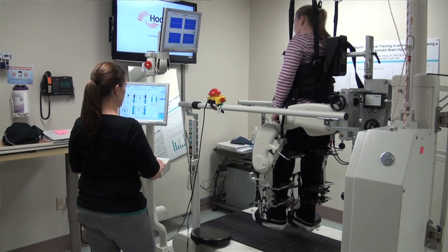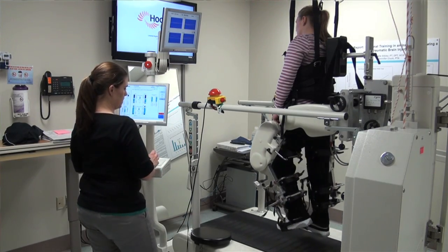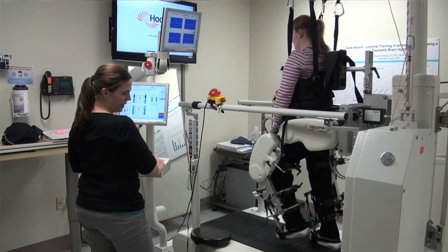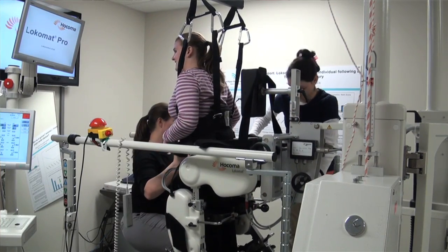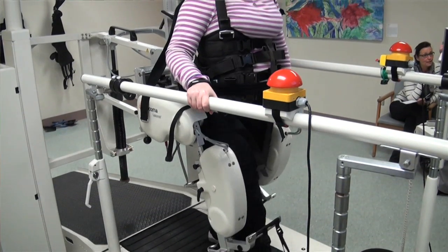The Lokomat is a body weight supported treadmill system where the patient gets put in a harness, lifting them up in the air and supporting them as much or as little as they need so their feet can move over the treadmill. What makes it specifically the Lokomat is that it has an exoskeleton — a big robotic piece that fits around the side of their legs and helps hold them up taller as they stand and walk, moving their legs through that normal position.